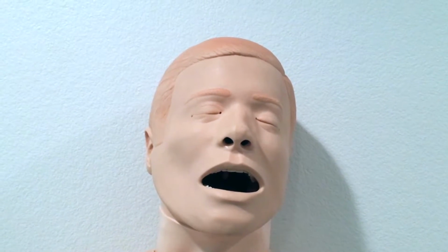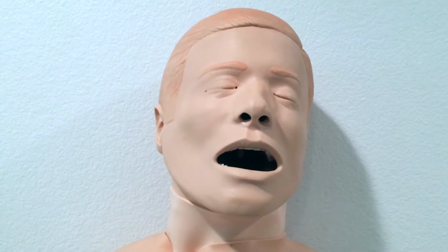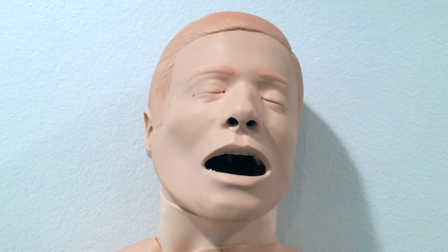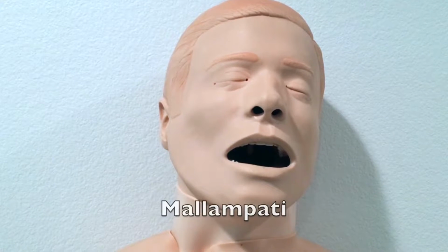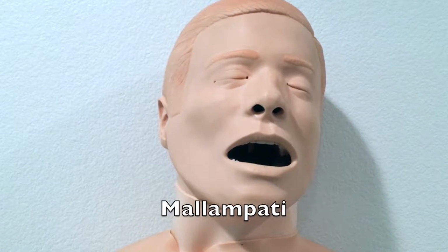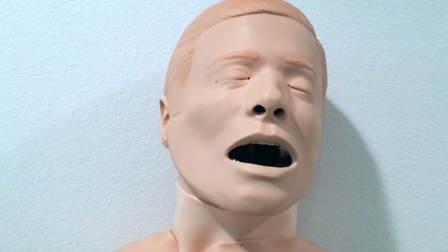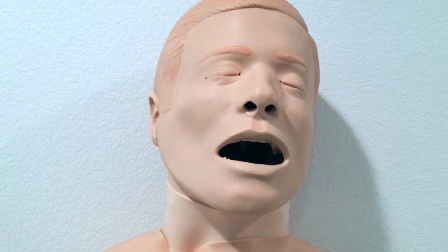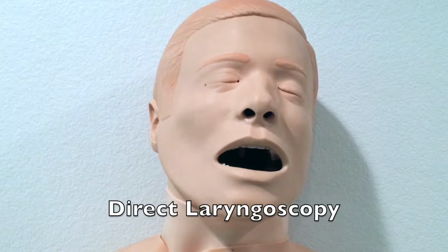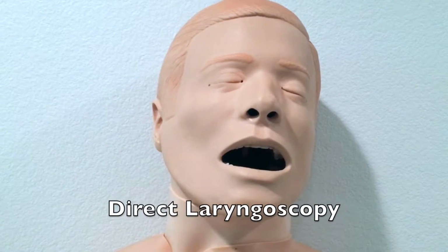Hello. So I'm going to be doing an airway assessment on Bob here, since he's the most willing participant I could find. An airway assessment consists of a variety of factors, one of them being a Mallampati classification or score. Basically it tells us how much space we have in the mouth to allow for ease when we use direct laryngoscopy or when we intubate.